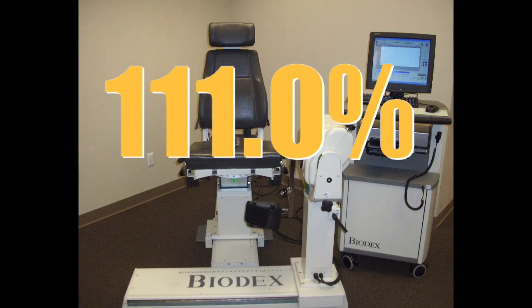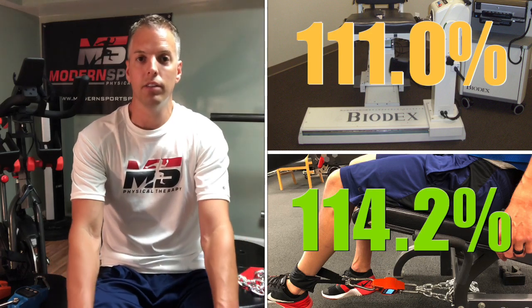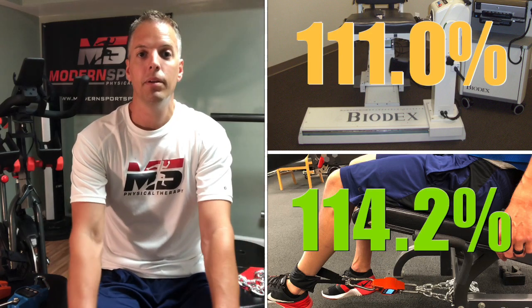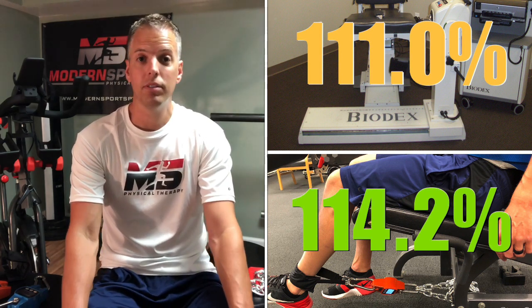Now let's look at the numbers I got when I tested my quads on the Biodex. My quad index was 111 percent — apparently my left leg is that much stronger than my right. Looking at the hanging weight scale setup, when I tested my quads I got 114.2 percent. Not exactly the same, but pretty darn close, and I'll take those numbers for fifty bucks any day of the week.